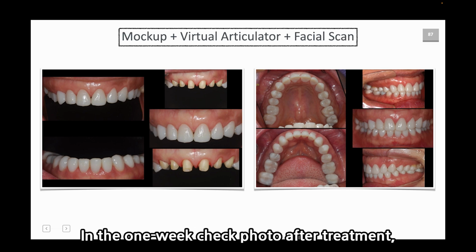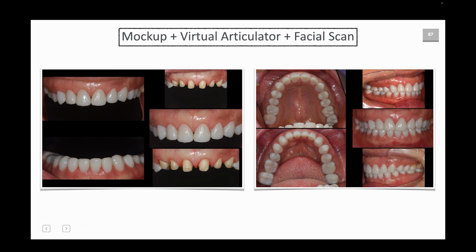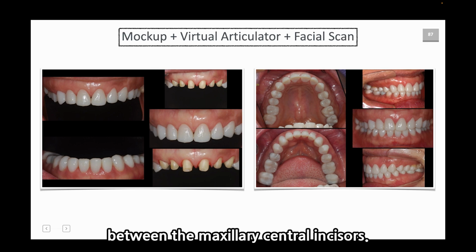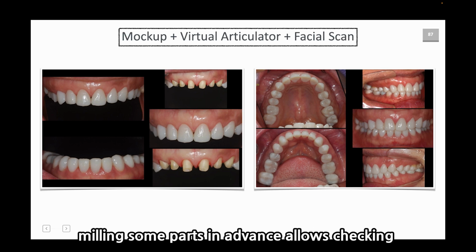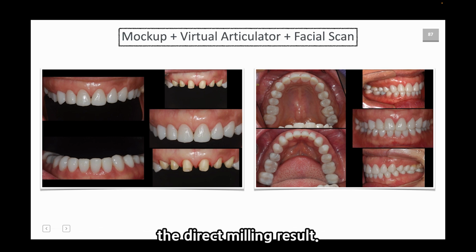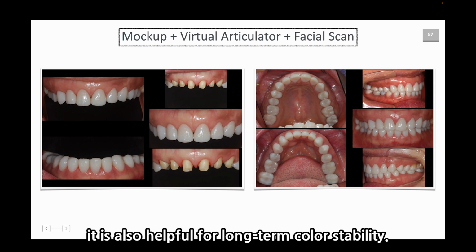In the one week check photo after treatment, you can see the well-healed interdental papilla between the maxillary central incisors. During the process of determining the tooth color, milling some parts in advance allows checking the direct milling result. Although the patient requested a slightly brighter and more opaque color, it is also helpful for long-term color stability.